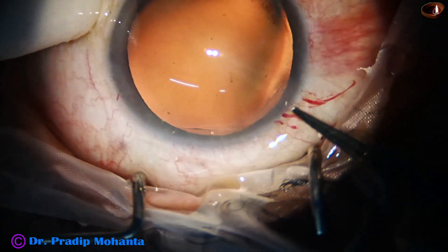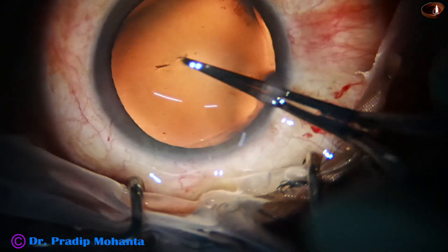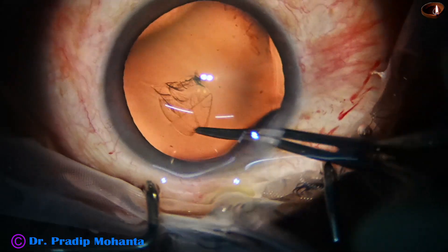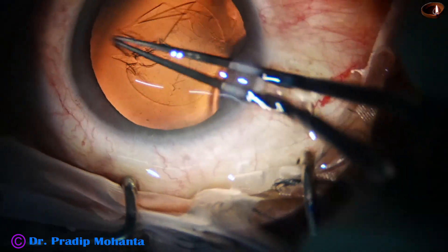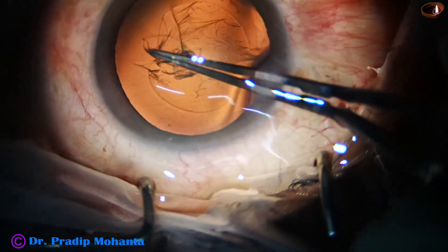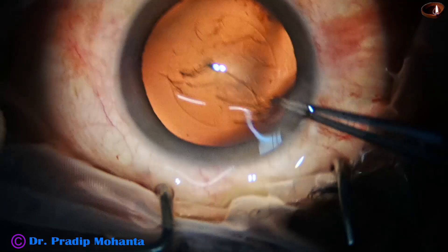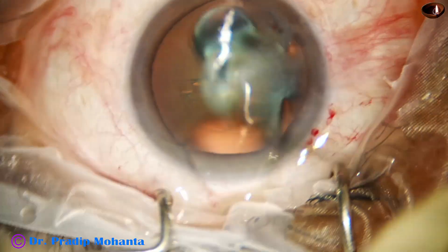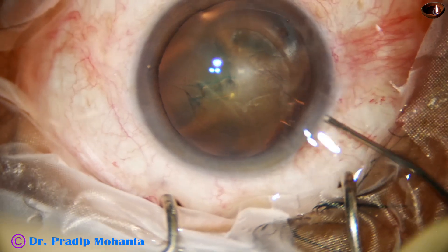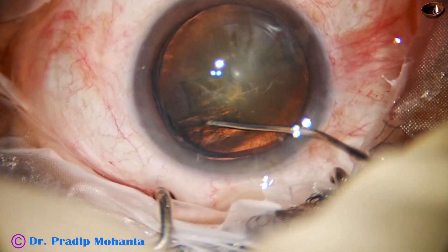And now capsulorhexis — capsulorhexis is done with the help of Utrata forceps. If we remain at a certain distance away from the margin of the pupil, we get a nice round rhexis. If we practice this mindful approach, in most cases we get a round rhexis.